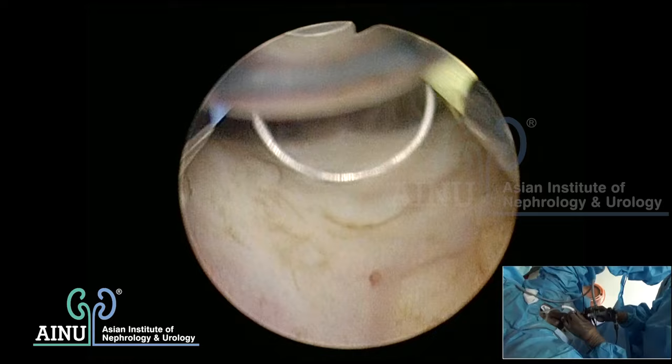That is the surgical capsule exposed in the floor of the prostatic urethra. You can see the bladder neck fibers. There are some ridges and elevations - those can be taken care of at the end, which is called toileting of the prostatic fossa. For bleeders in the prostatic fossa, do point-to-point coagulation. Do not rub the loop all across the prostatic urethra - just take pinpoint coagulation of vessels.